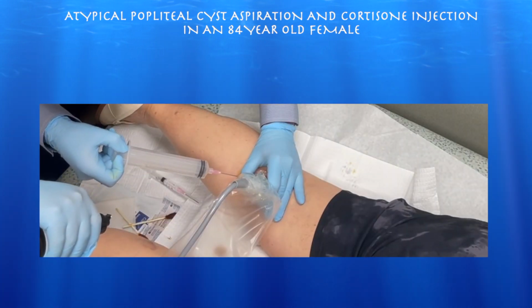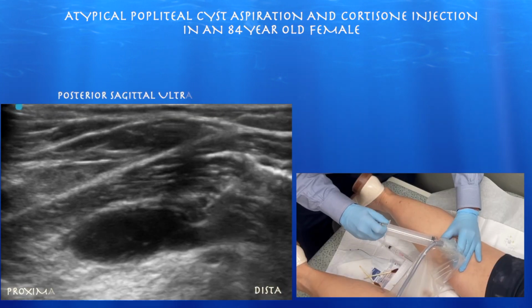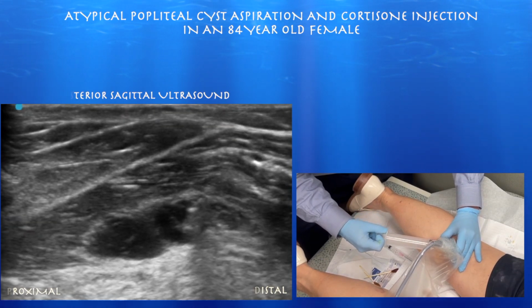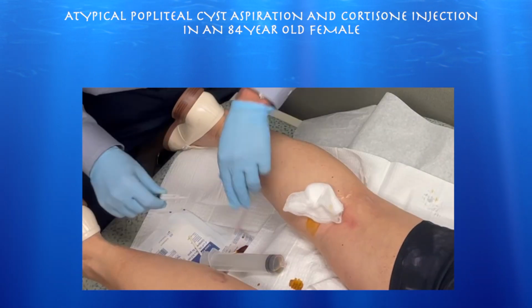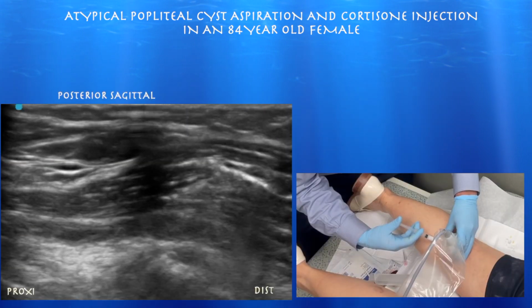So here we're draining this Baker's cyst. I've decided to go for the dominant lobe, the deep lobe, though again it's a little bit more of a risky procedure as you're getting closer to the vasculature. But here we were able to get into it pretty easily and then drain it. The fluid actually was a little bit thicker than I normally see, so it's almost like a ganglionic collection of fluid. Sometimes that can happen with these cysts.